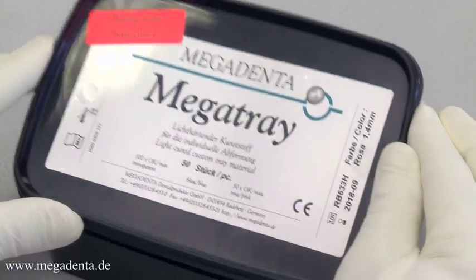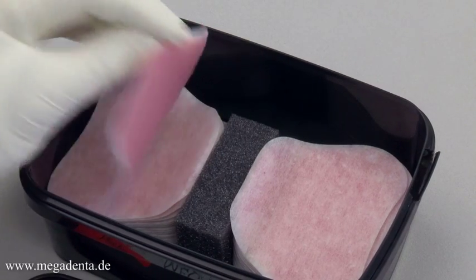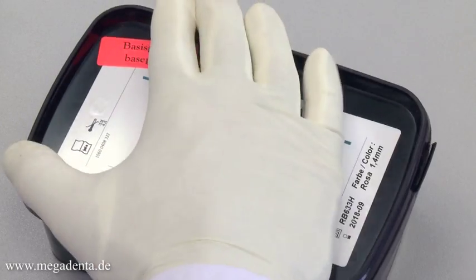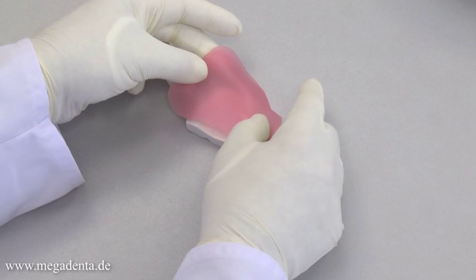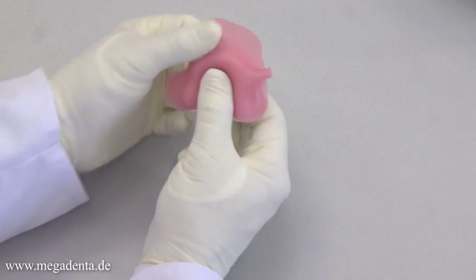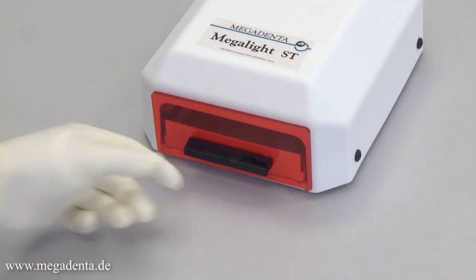Mega Tray Base Plate wafers are especially contoured for the fabrication of individual base plates or wax-ups. With a thickness of only 1.4 millimeters, they are very thin to give space for wax or future resin teeth modulation. The Mega Tray Base Plate can be adapted and customized with slight pressure on the model. The thin layer of Vaseline on the surface prevents sticking during modulation. The cut and light curing process is the same as the normal Megatray wafers.